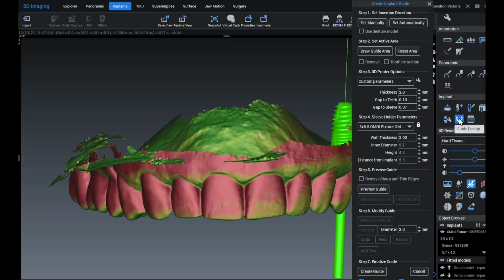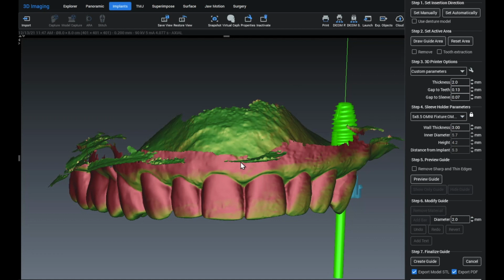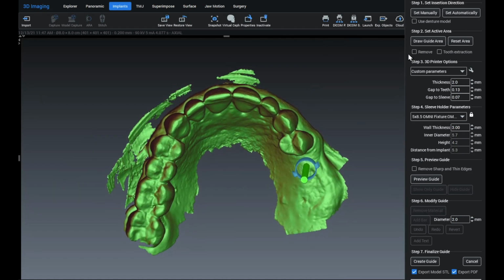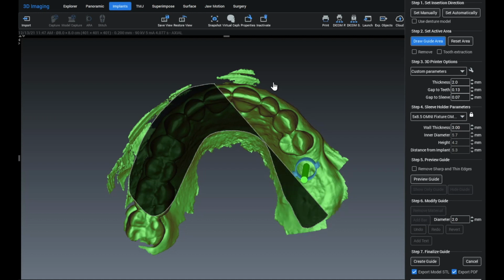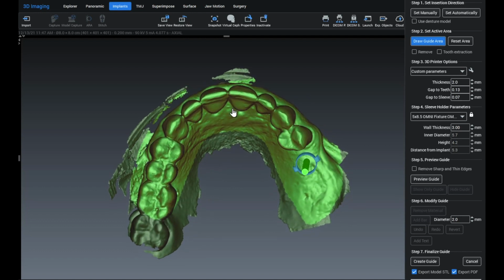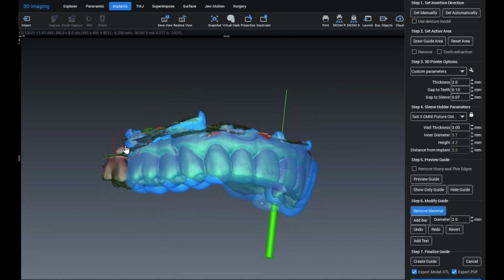And then when you go into your guide design, again, you want to make sure that your intraoral model or scan extends well beyond posterior to the implant site. And you're going to draw your area to be covered by the surgical guide and extend it well posterior to the implant site. So you want to go ahead and skip to show your guide, to preview guide, and you want to start making your trimming and adjustments.